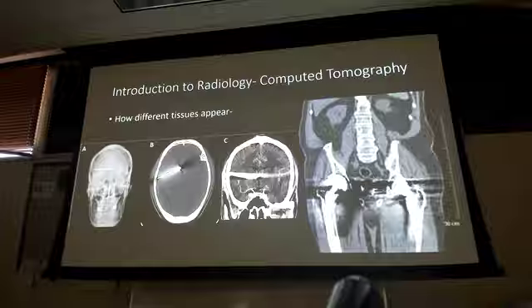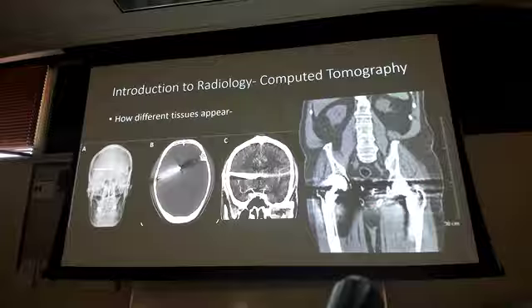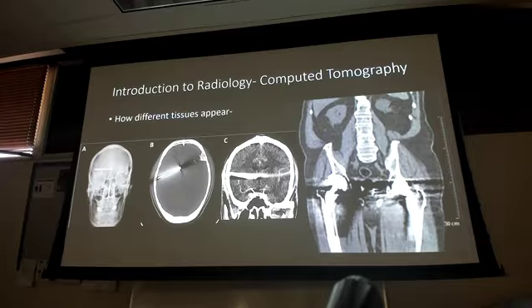Same thing's happening here, right? Bilateral total hip replacements, those things are dense. For those that don't know, especially the older ones are dense. Now they're starting to come out with plasticky, plexiglass-type replacements. But back when they were pure metal, that's not air all in there, that's just artifact from those devices. What type of slice is Bravo? Axial. What about Charlie? Coronal. Good. And then this one here? Also coronal. Good. Okay.